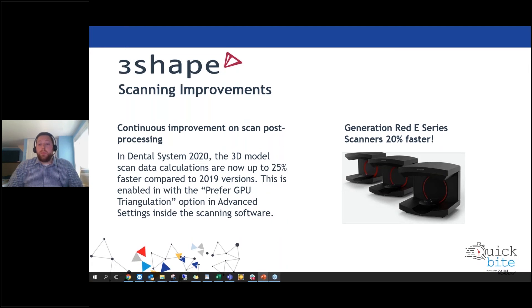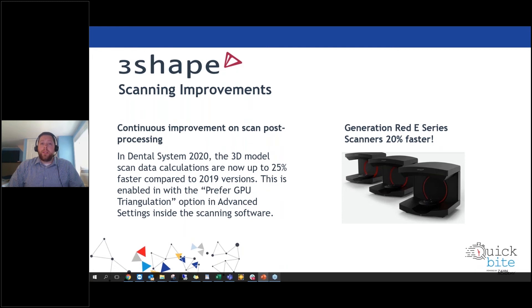3Shape also rolled out their new generation red E-series scanners, boasting a 20% increase in scanning speed. These new scanners have been upgraded to the same next-gen platform as the E4 scanner to provide faster and accurate scans that reduce scanning steps, save you time, and increase your productivity.